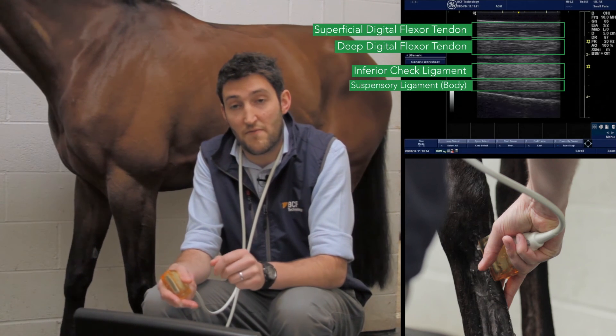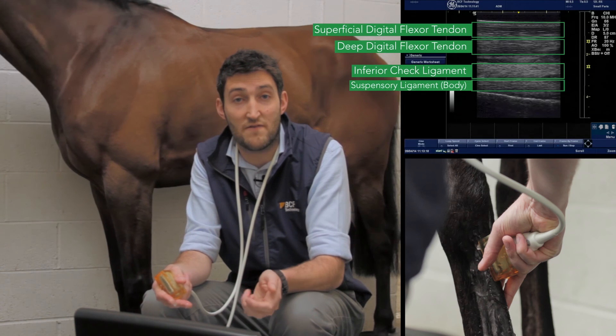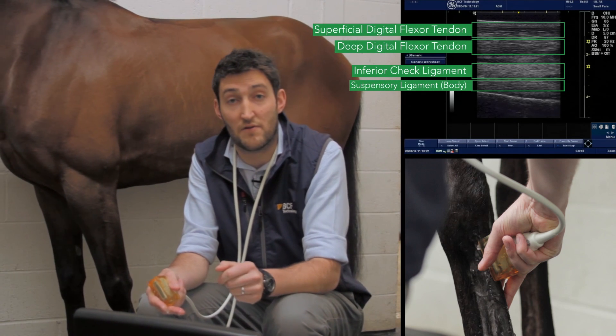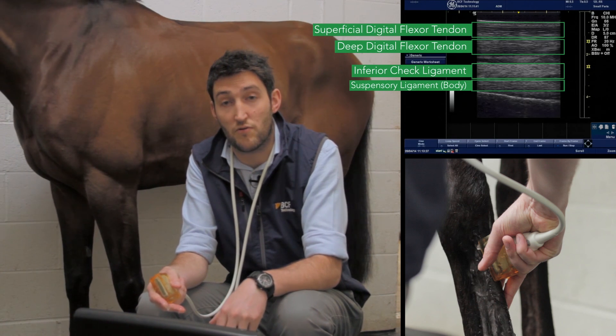It's quite important that as we go through taking these images, you just remember to save them and label them as well. We've already discussed how to do that, but just make sure — this is a clinical record and it's worth keeping those images as you go through.